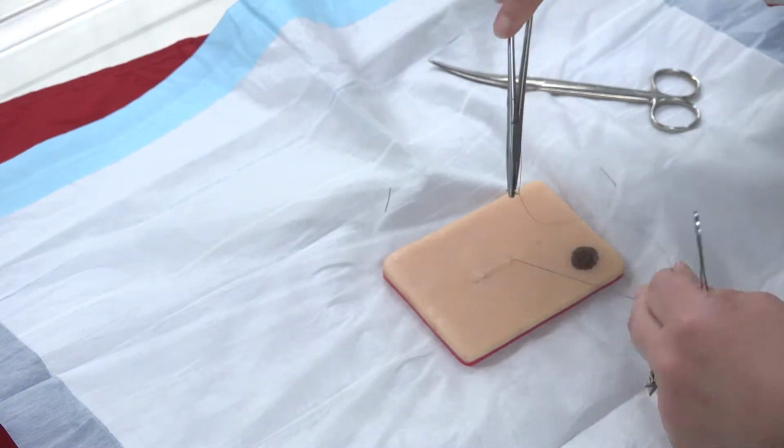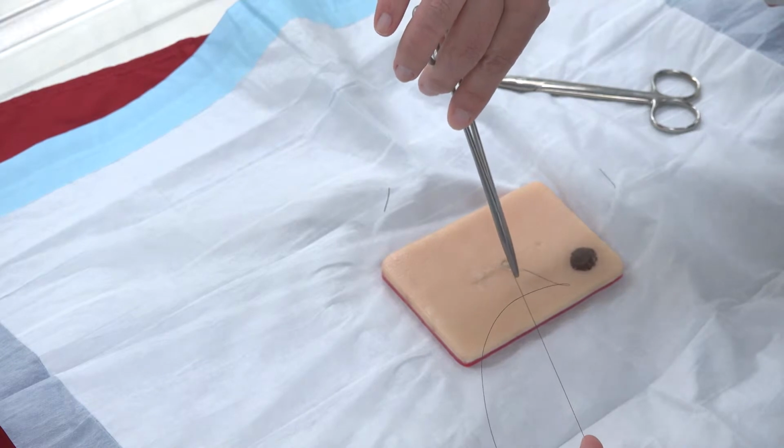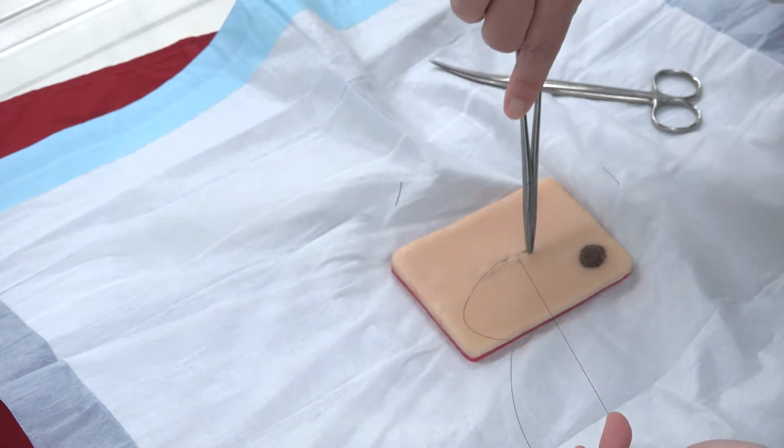The other mistake people make is that it's a curved needle. So every time you stick it in the other end of the skin, it's a curved motion, so you rotate your wrist, you don't push the needle through.